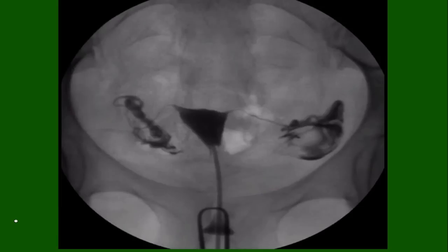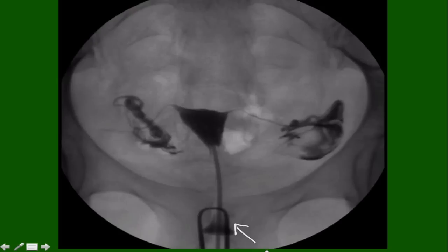This is another image of a normal hysterosalpingogram. Take note of the single-toothed tenaculum and cannula in the lower uterine segment. Next, we can see the uterus and the isthmic portion of the fallopian tubes. You can see where the tubes are getting a little wider — that's the ampulla. And finally, particularly on the right side, you can see crescent-shaped areas of dye. This is the dye freely spilling from the fallopian tube and wrapping itself around the bowel, giving us that classic crescent shape.